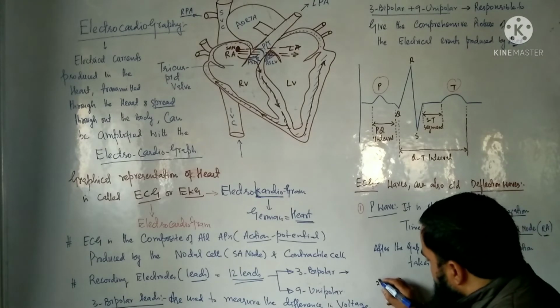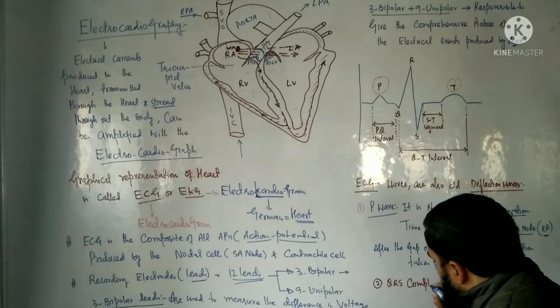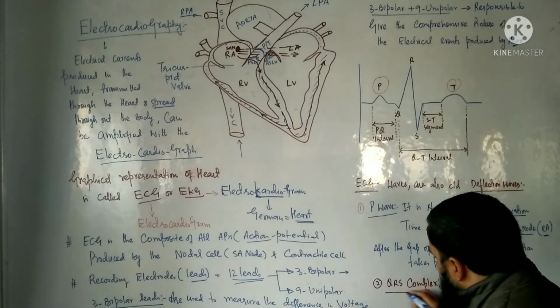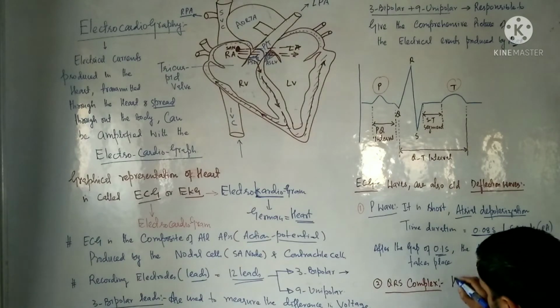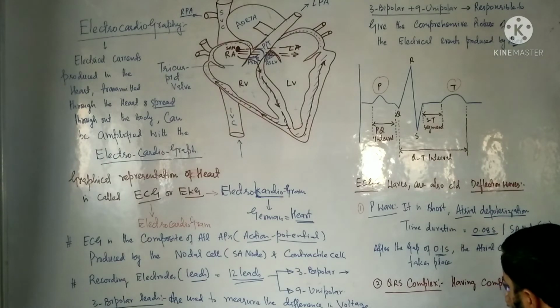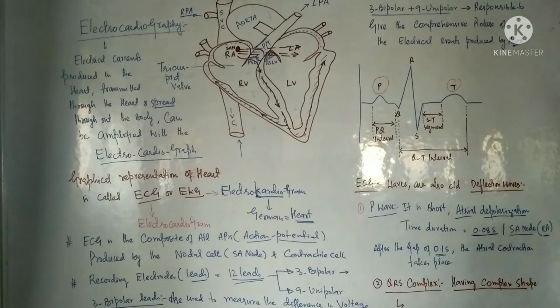Second point, the QRS complex. The QRS complex is a complex wave, or it has a complex shape. This QRS complex means ventricular depolarization.